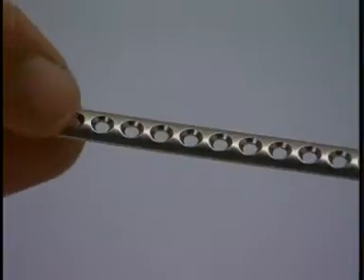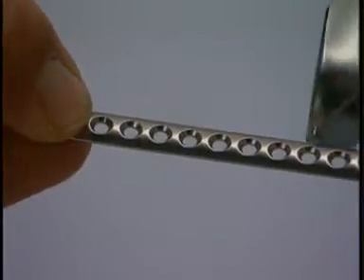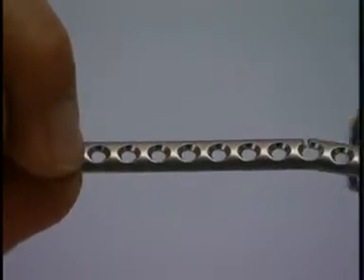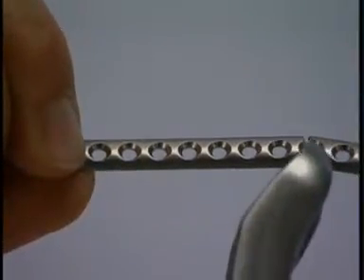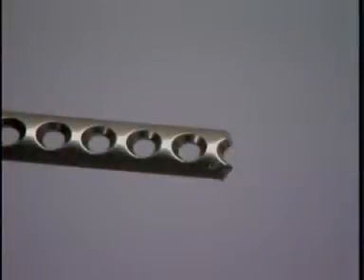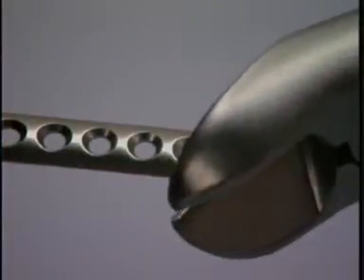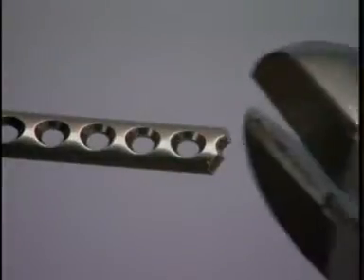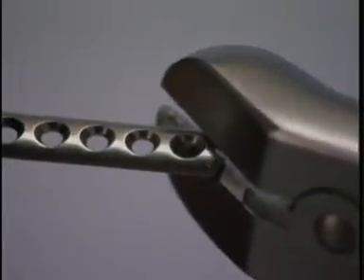The plate is cut to an appropriate length using wire cutters at a plate hole. Sharp edges are trimmed. Care must be taken so that plate fragments are not expelled from the cutter in an uncontrolled fashion.